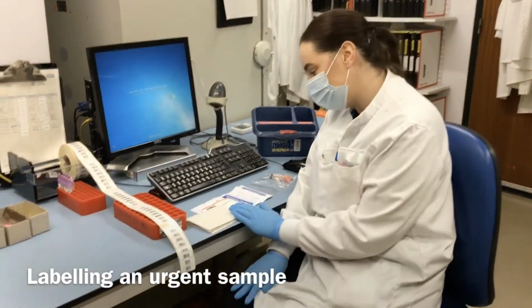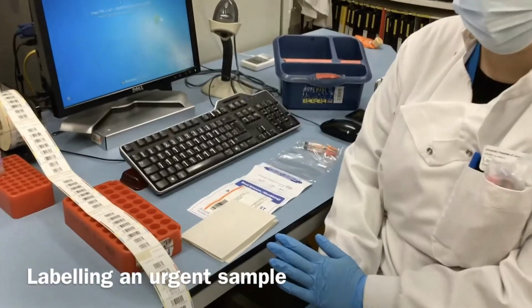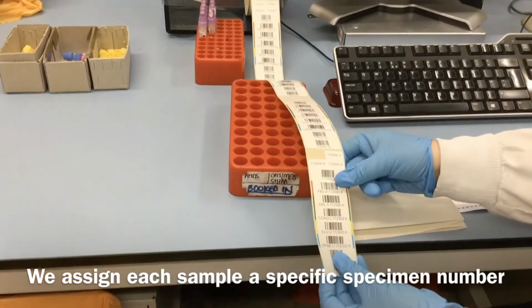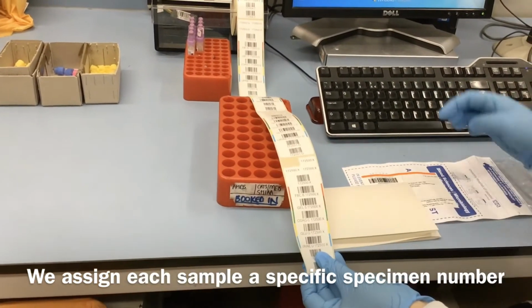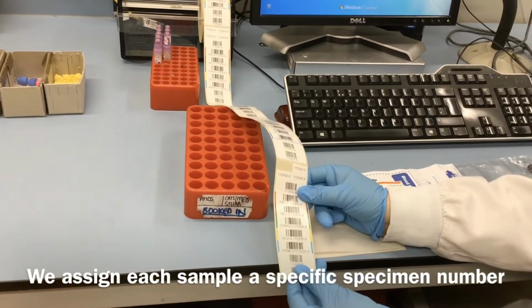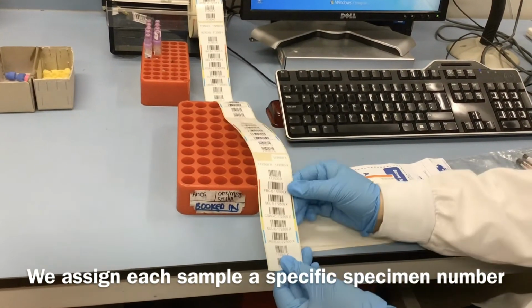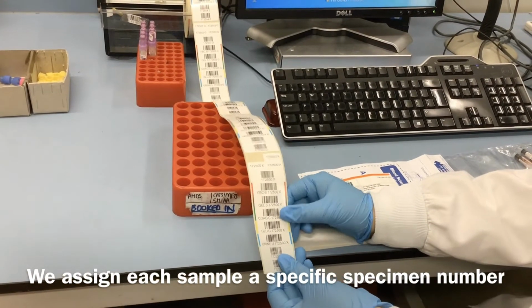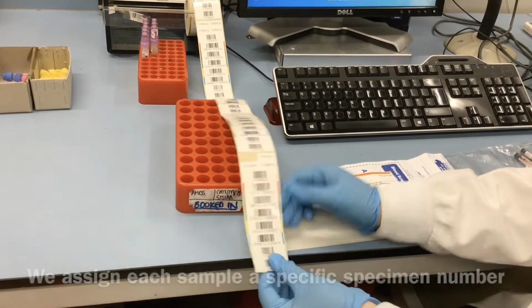We do lots of different urgent samples here, such as paediatric samples and coagulation samples. This is an example of an urgent ICE form. We assign a different sample with different numbers. We use a barcode we place over here. We use different samples for different colours. As you can see, the red goes for the FBC, gel is the chemistry, and the coagulation is the green.